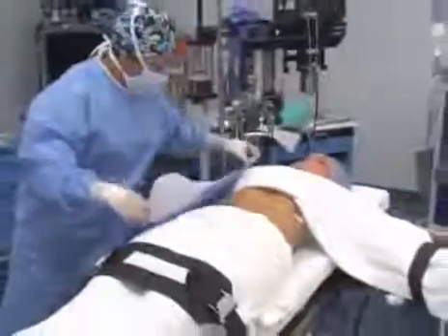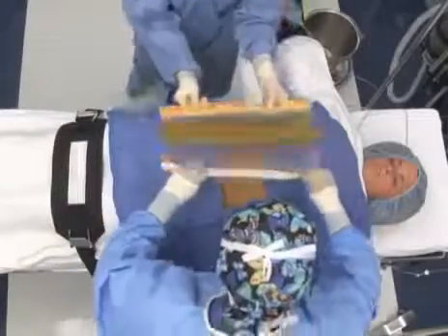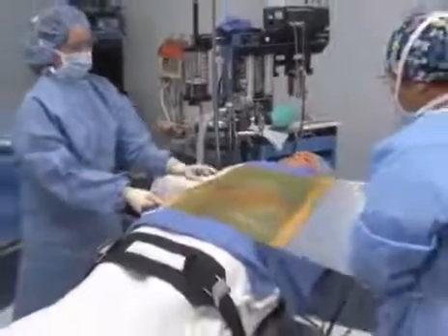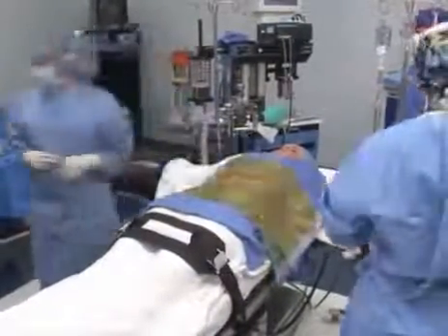The following guidelines support the principles of asepsis and safety during draping. Handle drapes with as little movement as possible. This reduces the risk of contamination and prevents release of airborne particles that can become vehicles for bacteria. When placing a drape, do not touch the patient's body or any other non-sterile surface. Remain a safe distance from the patient to avoid contamination of your gown. After a drape has been placed, do not shift or move the drape.